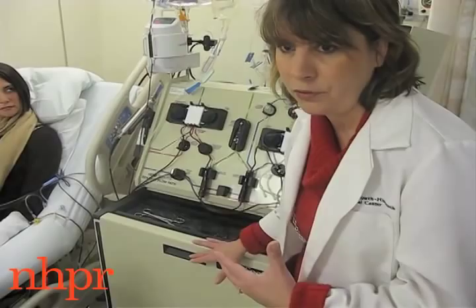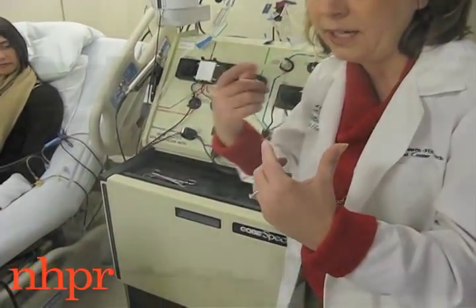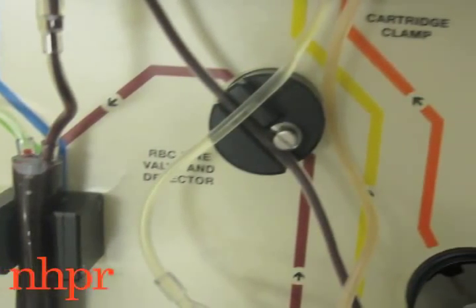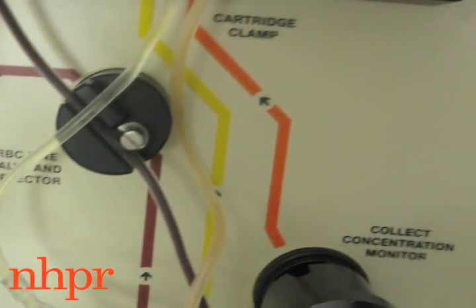Down here is the centrifuge — there's a belt that's spinning it. Her blood is coming into this machine and being spun out so that we can separate it and collect the stem cells.